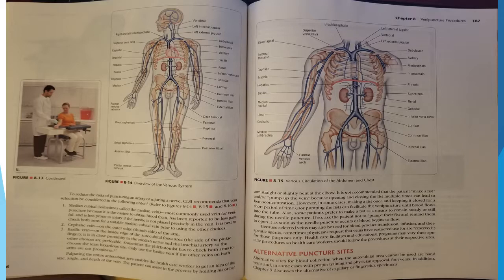Also, some patients prefer to make a fist as a means to remain steady or still during needle puncture. If so, ask the patient not to pump their fist and remind them to open it as soon as the needle puncture occurs or blood flow begins. Because selective veins may also be used for blood product transfusion, infusion, or therapeutic agents, sometimes physicians request that veins have restricted use or are reserved for those purposes only. Healthcare facilities and educational programs may vary by specific procedures, so healthcare workers should follow the procedures at their respective sites.